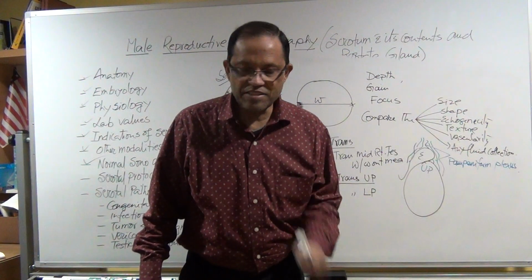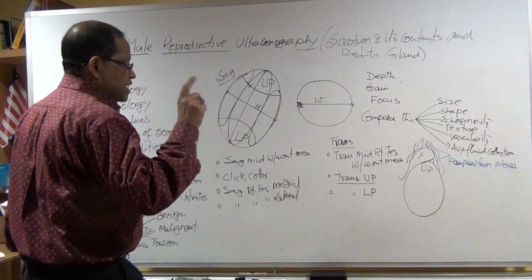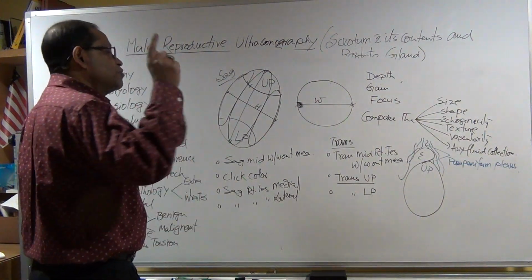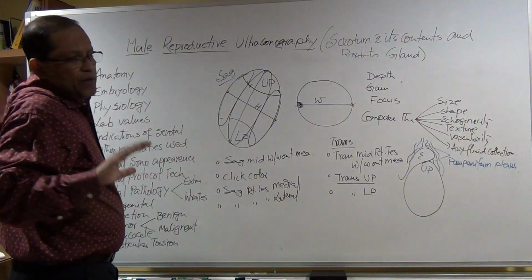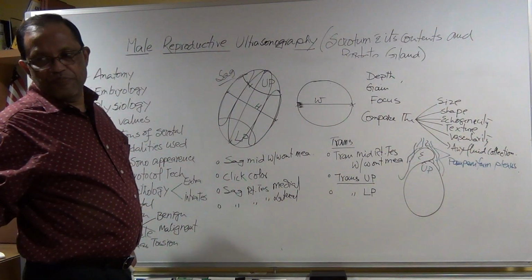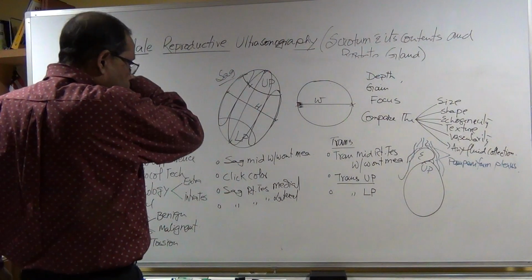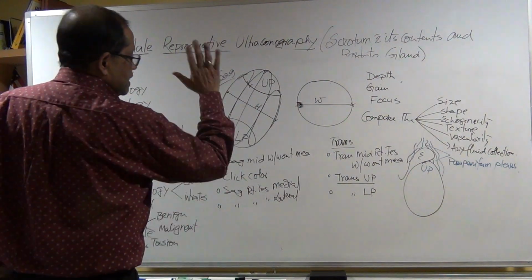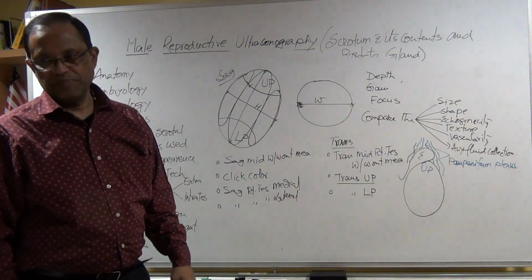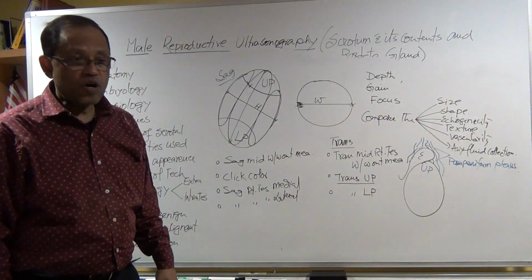Got it? Good. So if you suspect, then you do it. If you see no chance of varicocele, then don't waste time. Okay, so that is complete, the right side is done, same thing on the left side.